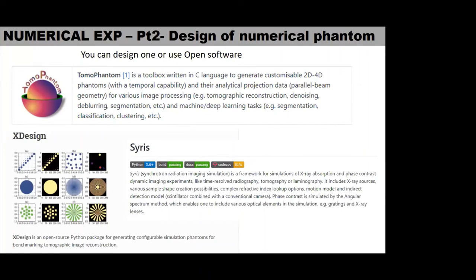I think it will still stay mainly as a research tool, because they are very advanced techniques with lower dose to the patient and fast acquisition that can actually do something similar to what multiple energy CT is doing.